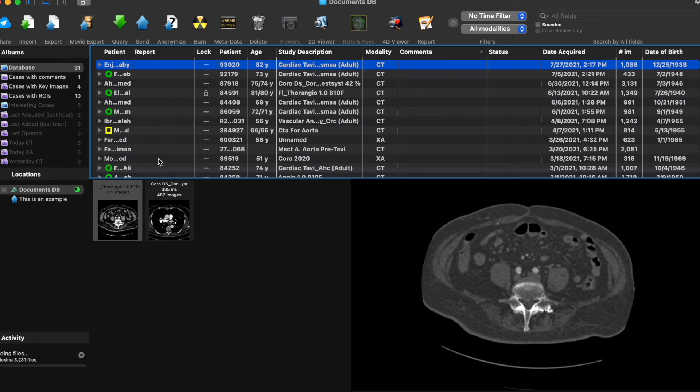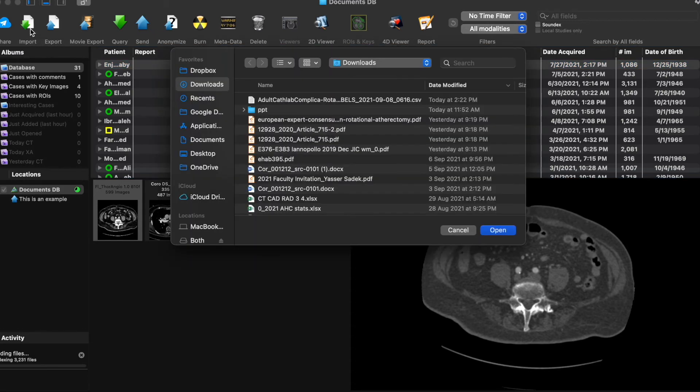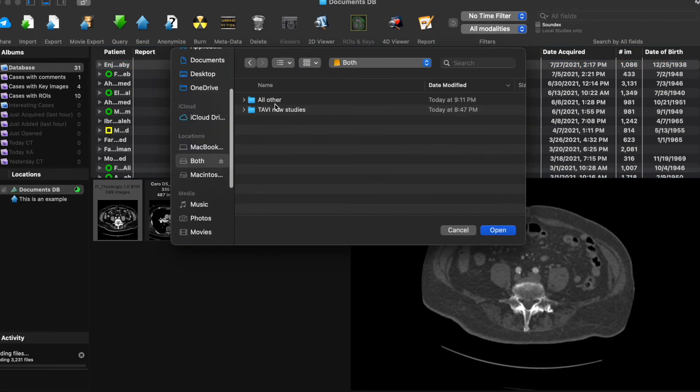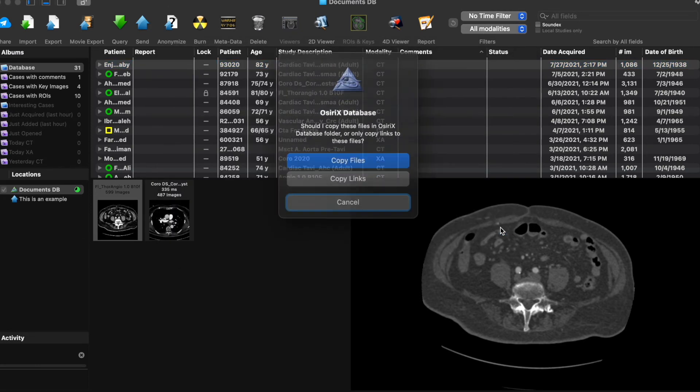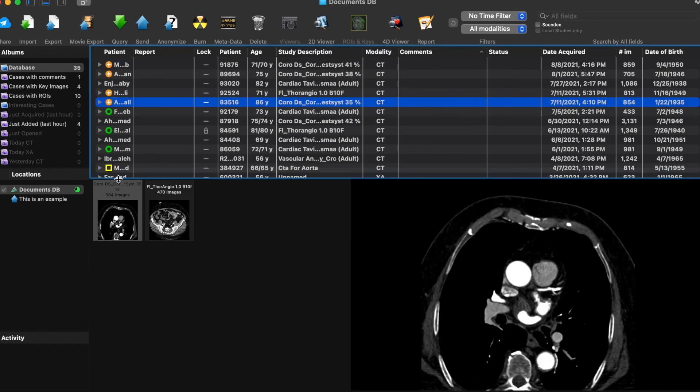The second one is that you use the folder itself. So you press on the import, just right here. And then you open it, and then this will take a little while. The new files are going to be with a plus sign beside them, indicating that those are newly imported.